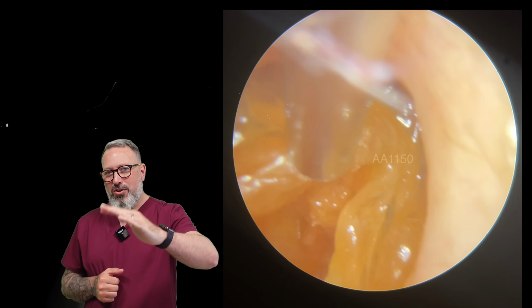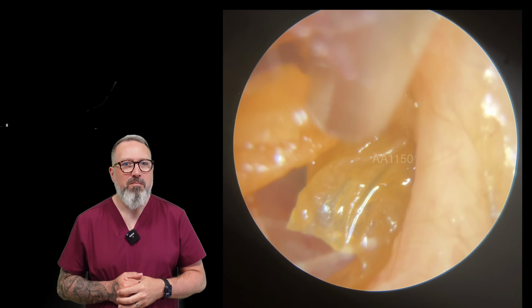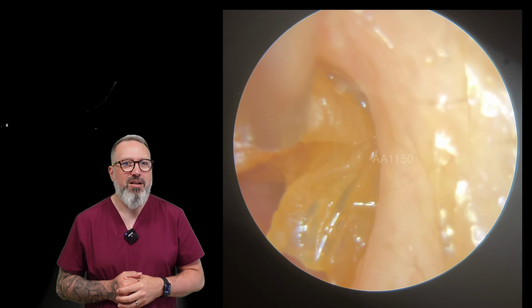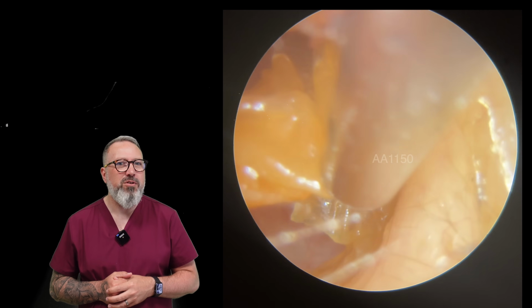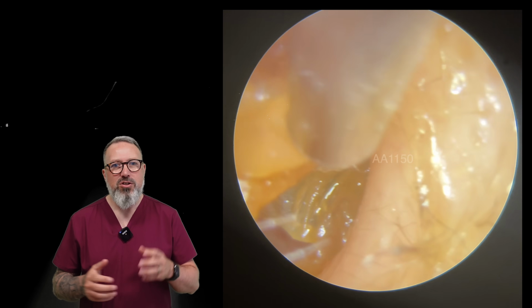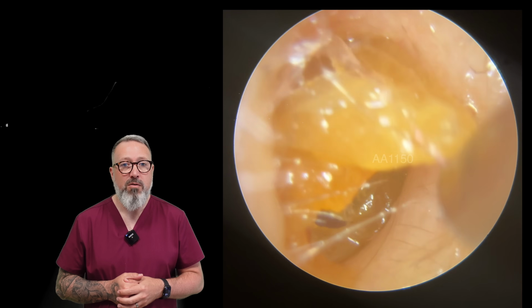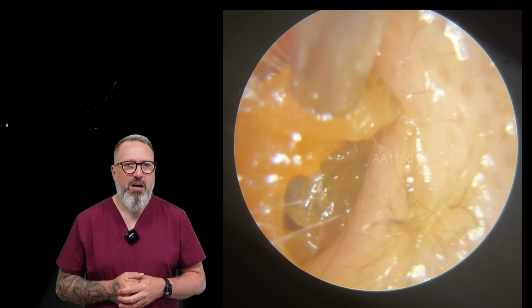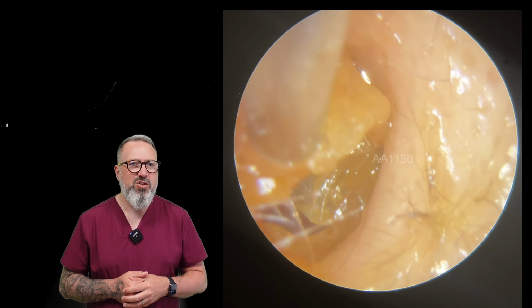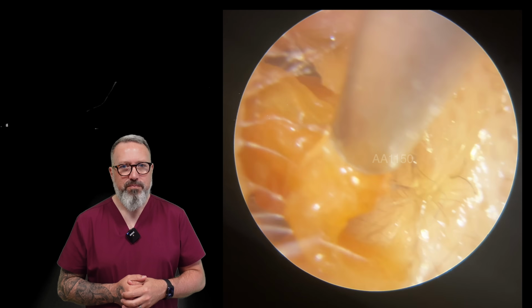I like the fact it's got that little ridge there. That's usually a good indication it's going to come out well. So let's see if he's turned it a little bit, and looking at the bottom left corner, it does look like it's detached away from the canal wall there. Now you could switch up at this point if you wanted to, and you could use the forceps on here as well. But this looks like it's coming forwards nicely at the moment. I think if this stalled and got a little bit more stuck, then I'd be tempted to go in with the forceps at this point.